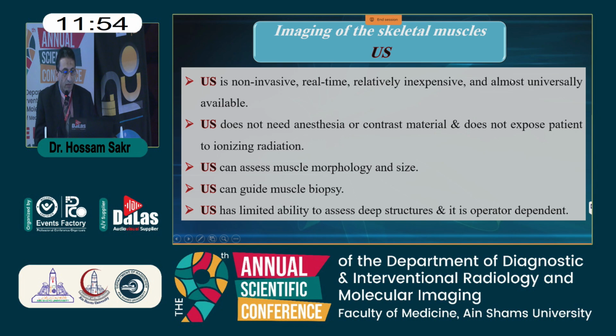Coming to ultrasound, it is non-invasive, real-time, relatively inexpensive, and almost universally available. It does not need anesthesia or contrast material, does not expose patients to ionizing radiation, can assess muscle morphology and size, and can guide muscle biopsy. But it has limited ability to assess deep structures, and it is operator dependent.